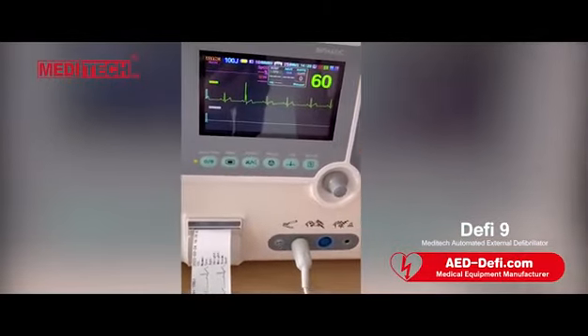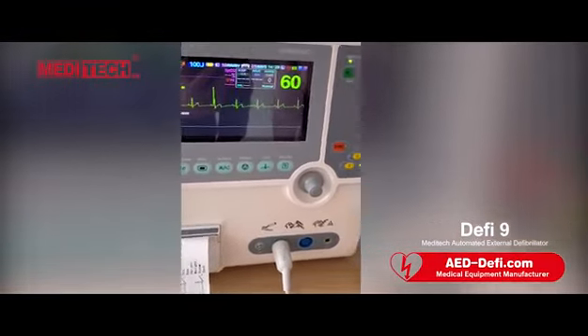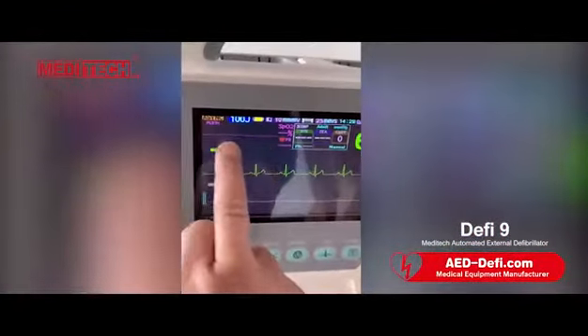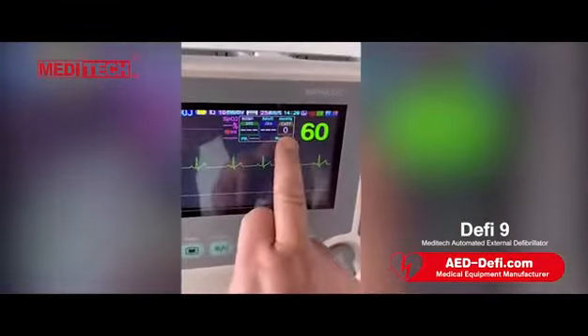This machine can optionally have AED, like this. This is SpO2. This is NIBP, and this one is for kids.